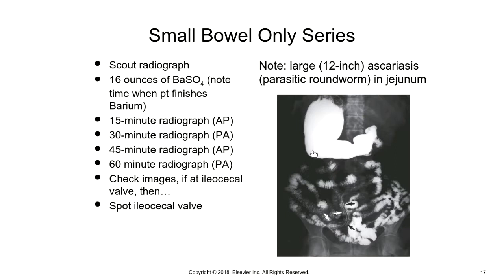In this particular image, it's kind of cool. This is actually, the radiograph can be seen on, let me find this for you. Well, I thought I knew where it was. This particular image has a parasitic roundworm in it.